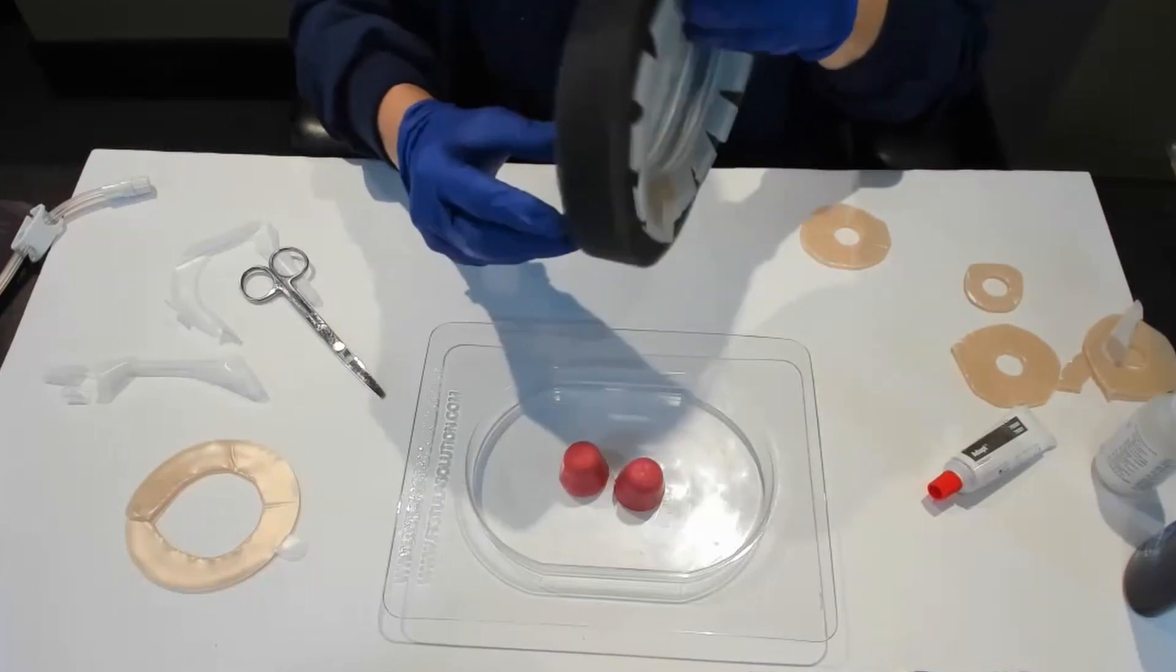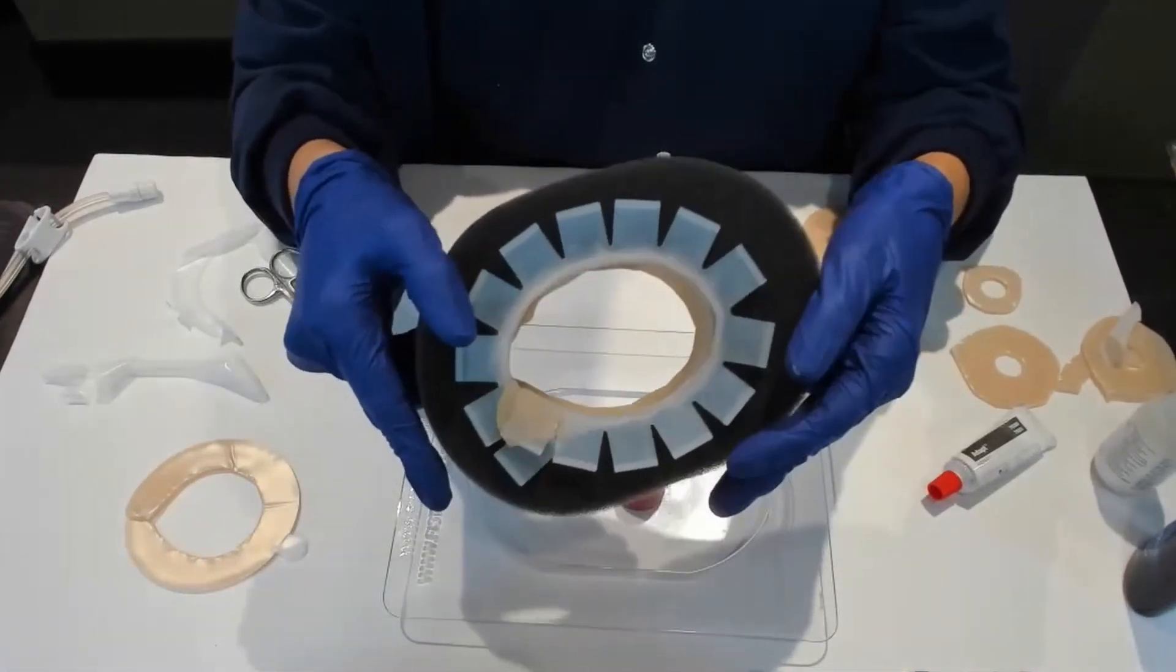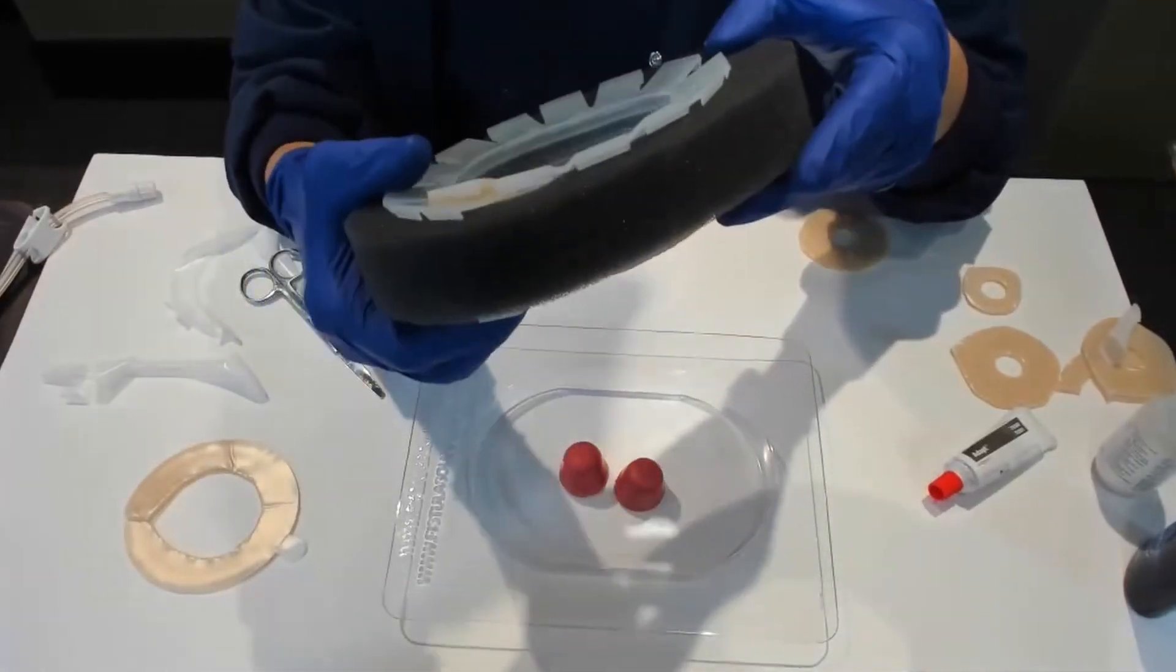Then you're just going to check to make sure you don't have any bad spots. You can see it on the inside and the outside. That's very important.